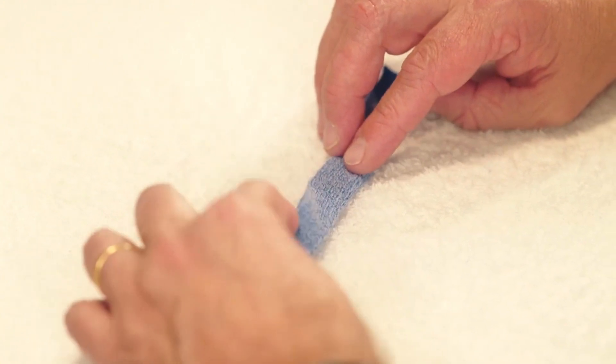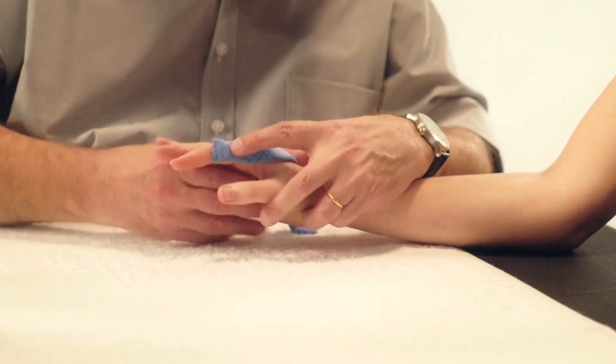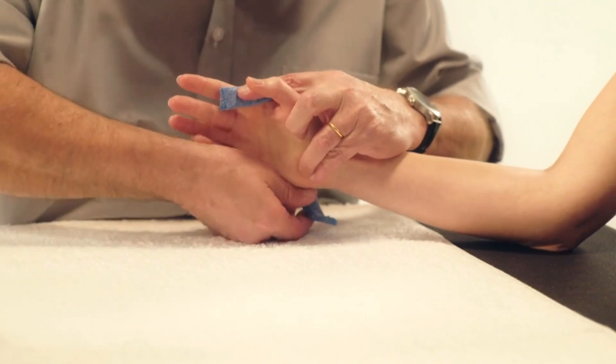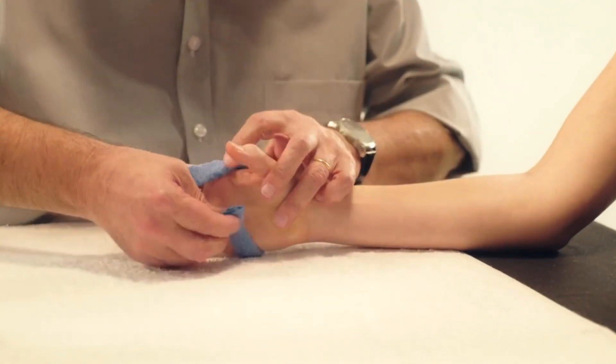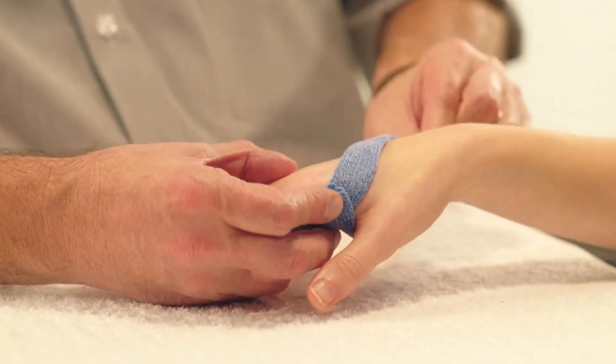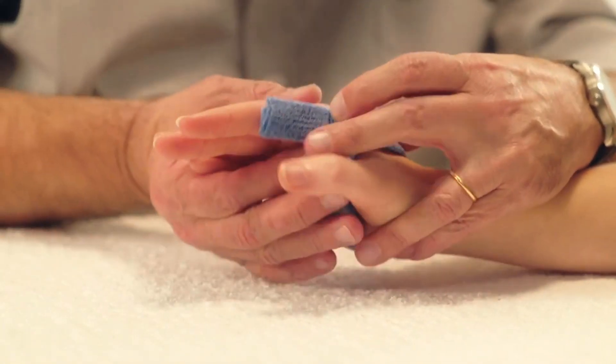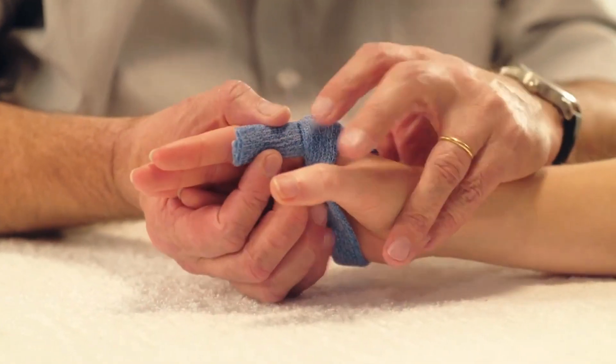Apply the Orphicast beginning from the lateral side of the index finger just below the PIP joint. Cover the dorsal surface of the metacarpals, then pass the material onto the palmar surface of the hand. Connect the two ends of material on the lateral side of the MCP joint of the index finger.